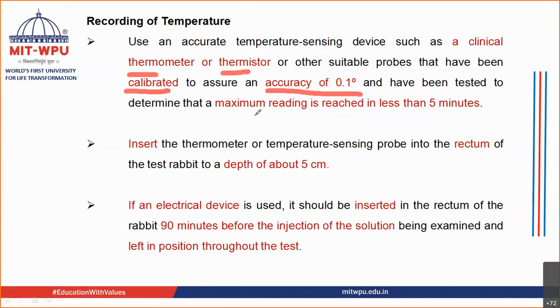The maximum reading should be reached within 5 minutes. We are going to insert the thermometer into the rectum of the animal at a depth of about 5 centimeter.